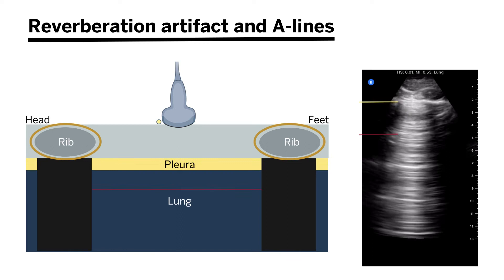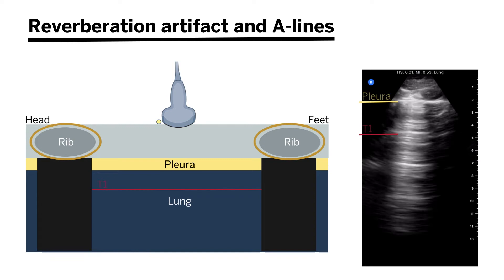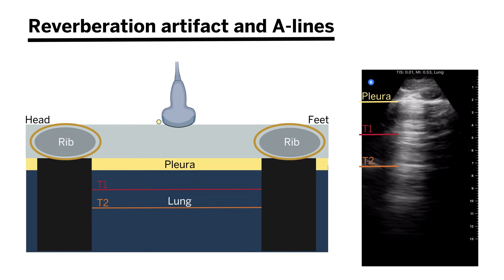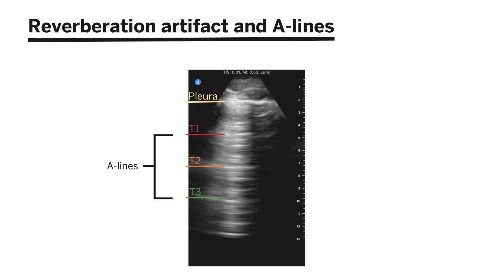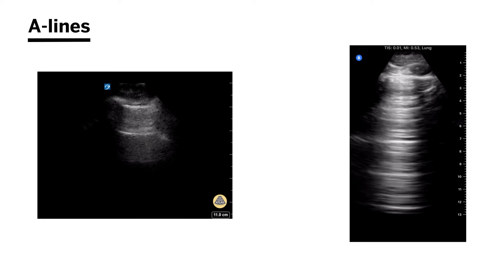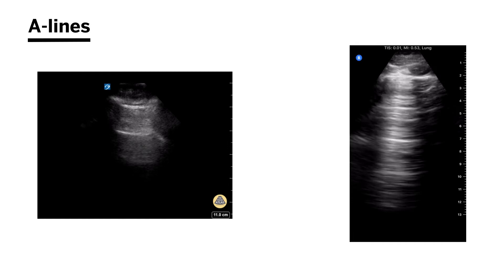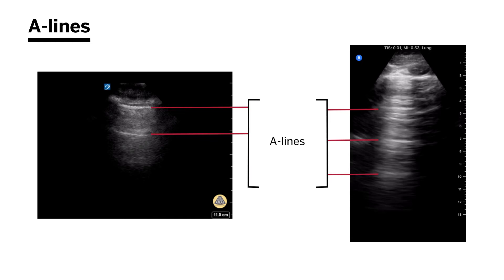Remember that the longer it takes for sound to return to the probe, the deeper the machine thinks the structure is. Sound will continue to reverberate at time one, time two, and so on. Since each reverberation takes longer to return, the machine interprets each as being even deeper, creating a horizontal artifact seen between rib spaces known as an A-line. You can appreciate a little lung sliding at the pleura, and then at equidistant depths from the pleura you'll see these horizontal repeating artifacts — the A-lines. A is for air: it simply means you're insonating an air-filled structure.